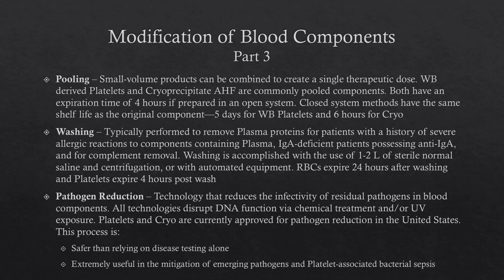Washing is done to some cellular blood components, mostly with RBCs. Platelets are sometimes washed also, but in either case, the objective is to remove plasma proteins for patients that have got a history of allergic reactions.